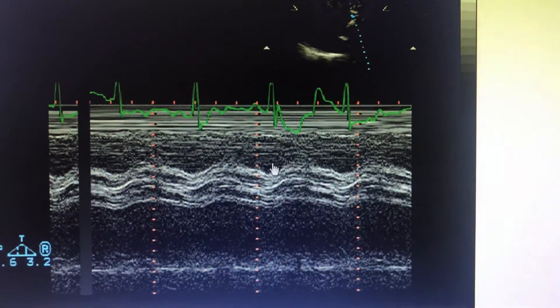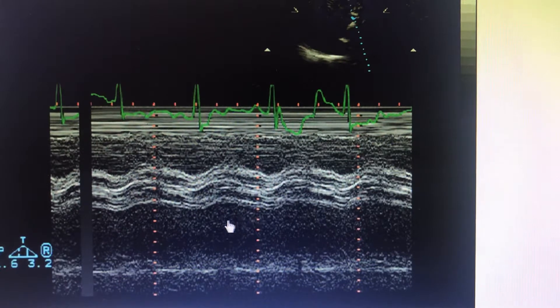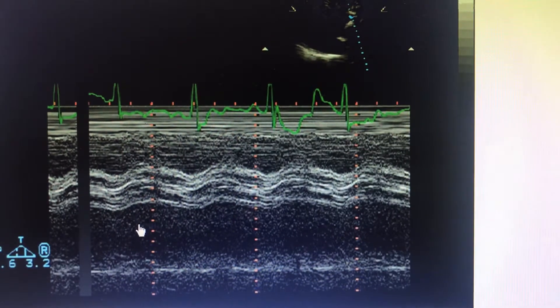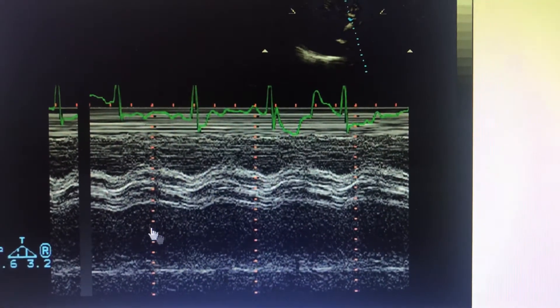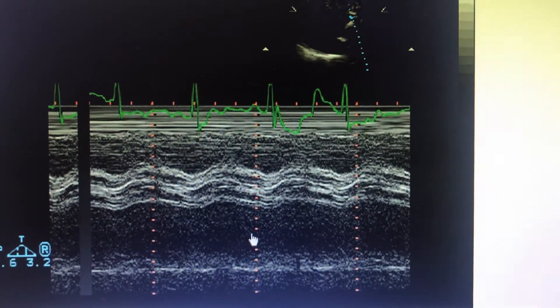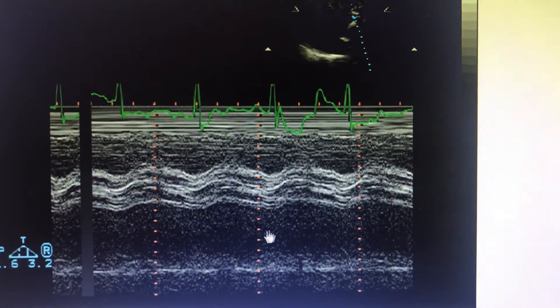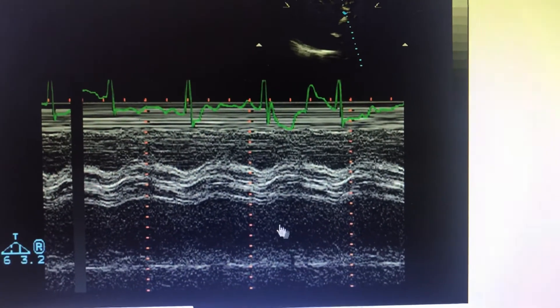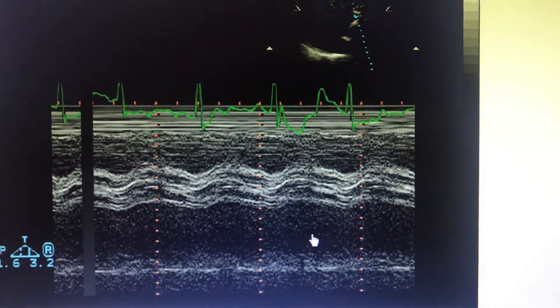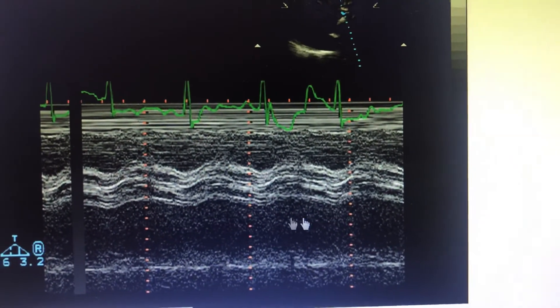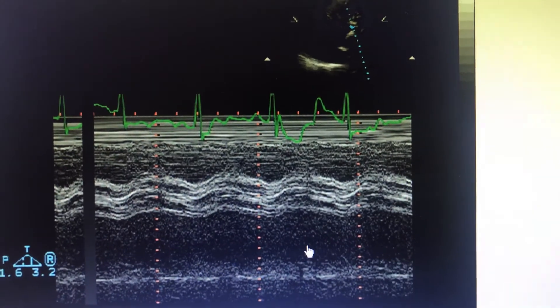Other findings which can be seen in the same patient on M-Mode include LA enlargement because of LV diastolic dysfunction. The LA enlargement can be seen, and these findings should give you a hint that the patient has aortic stenosis.